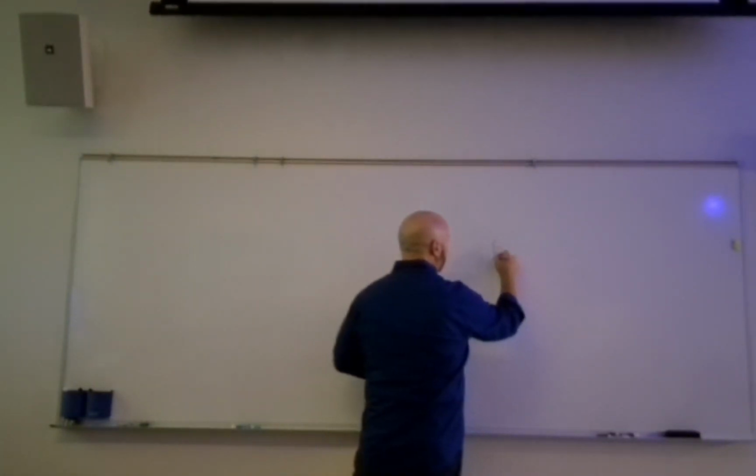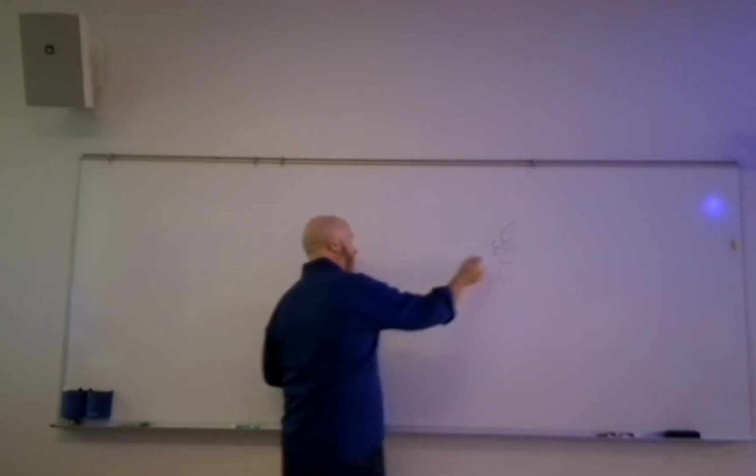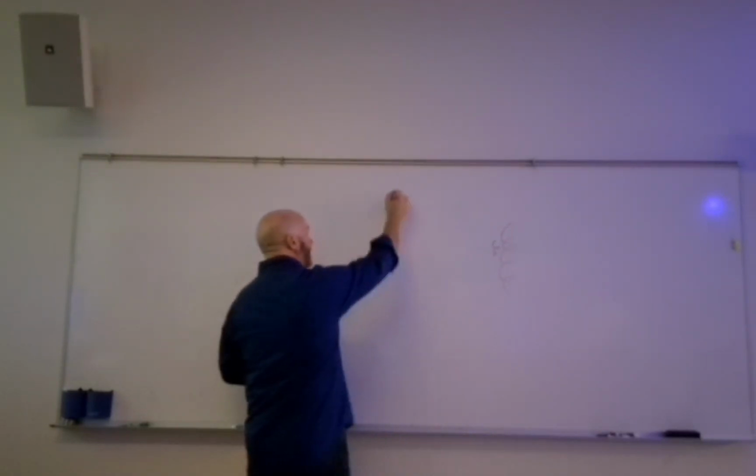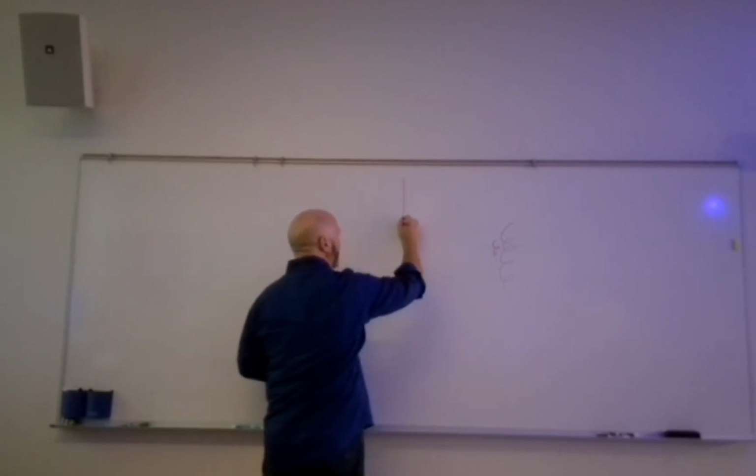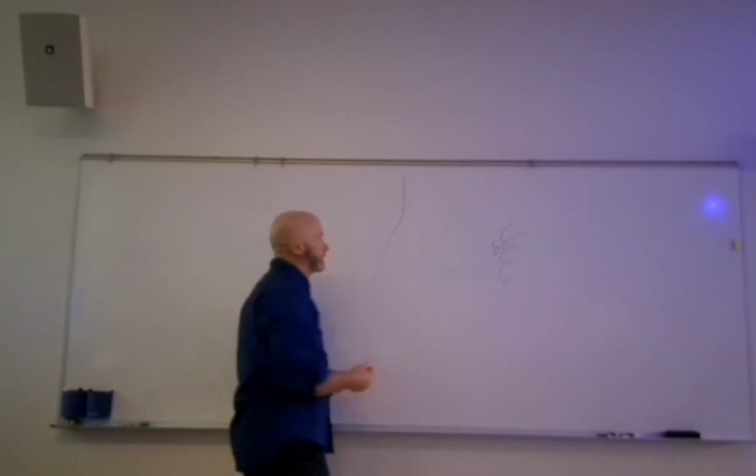Bring it up, and just kind of show you what I'm talking about. Because the stream of electrons is pretty obvious, right? You're going to get a sharper image out of that than out of that. Okay? Because you're going to have a smaller stream of electrons. But at the same time, you've got your anode, and the angulation on the anode is 15, 17 degrees.